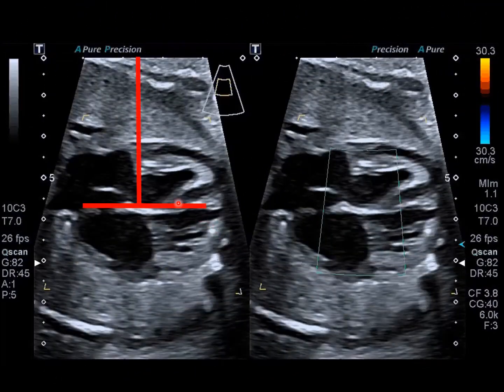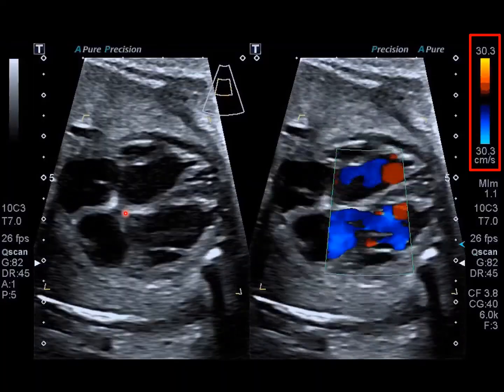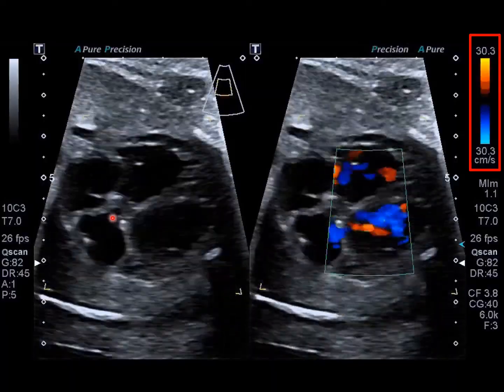So moving on to this 4-chamber view, in terms of looking at the atrioventricular septum and the ventricular septum, the atrial septum, you really want to try to align these cardiac septa, the atrial and ventricular septum, perpendicular to the plane of insonation as possible to evaluate for ventricular and atrial septal defects. Specifically at the crux of the heart, you want to really closely evaluate that to make sure that the insertions of the AV valve leaflets are such that you can see the crux intact.